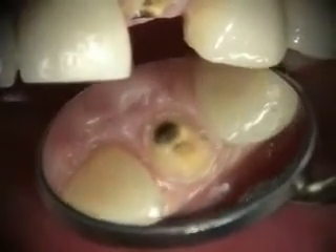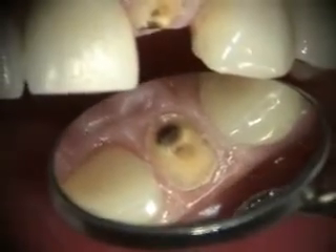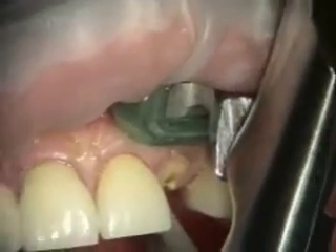The tooth just fractured. We're going to be replacing that with an implant and an immediate provisional today. We're using the physics forceps.